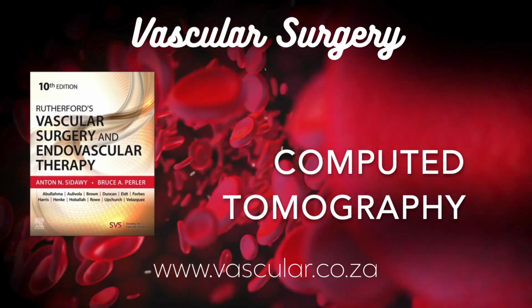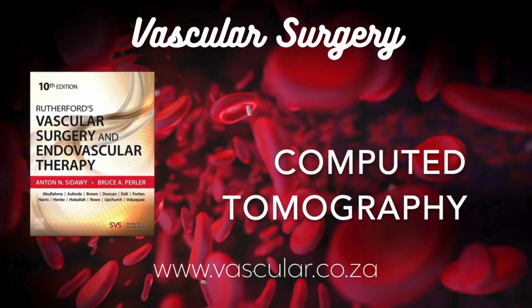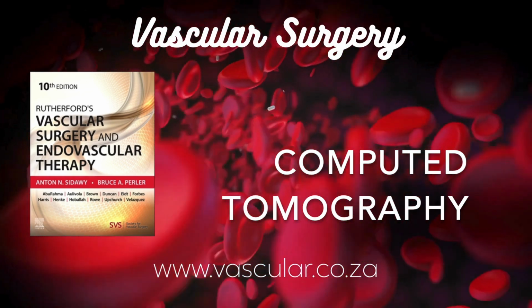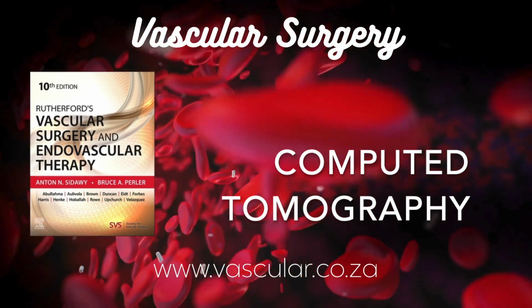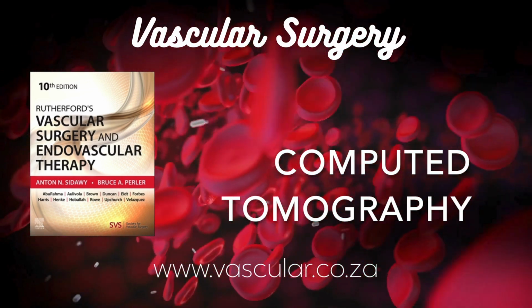Okay, risks acknowledged. What about things that can just mess up the images? Artifacts. Oh yeah, lots of potential pitfalls. Partial volume artifacts happen when a structure is only partly in the slice thickness. It can average the density and sometimes make it look like something's there when it isn't, like a fake lung nodule near the ribs. Okay.